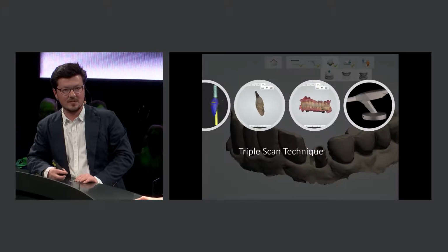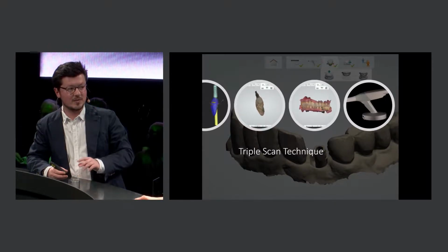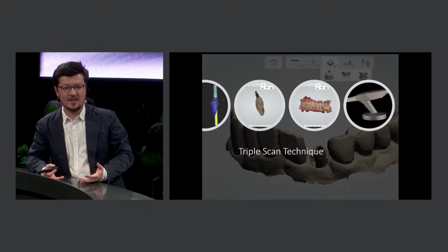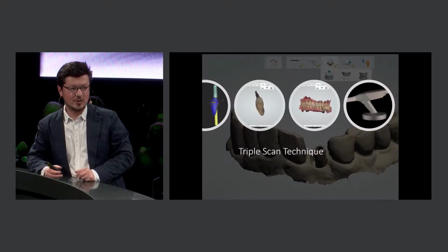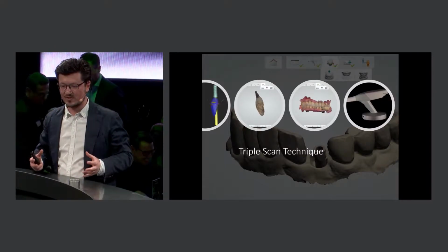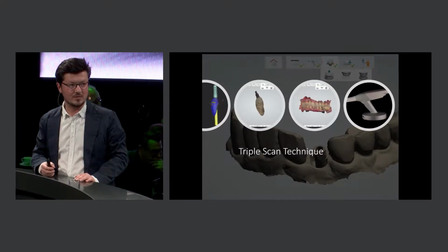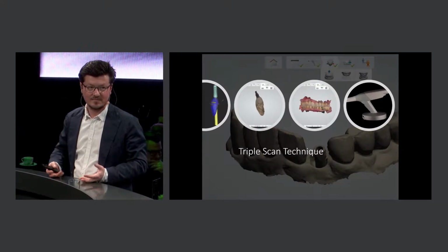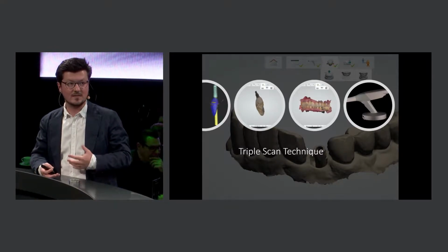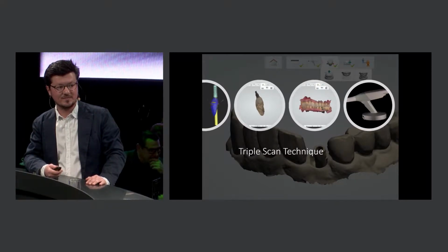We used the TRIOS intraoral scanner and performed 3 scans: the first with the crown on site, the second with the crown alone, and the main scan with the scan body. So we managed to provide the technician with all the data. He matches all 3 scans and can follow the anatomy of the provisional. Otherwise, it is not feasible. This time he was working in exocad, but it's possible to use different software. Everything is open.